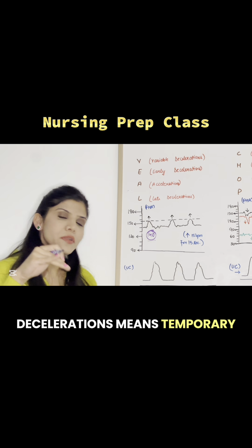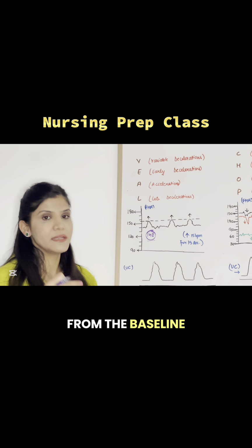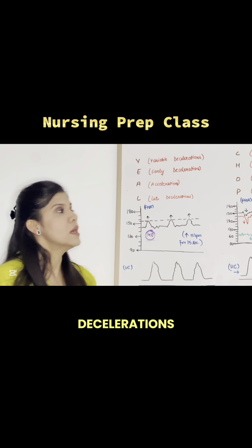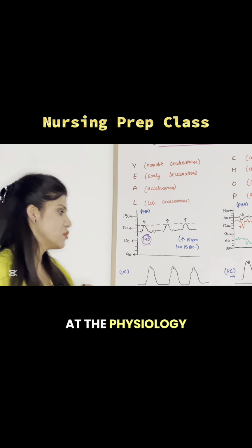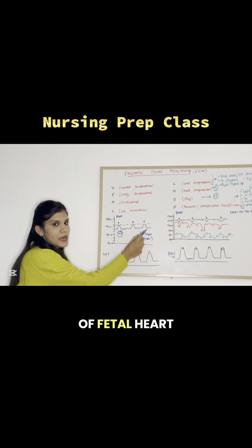Decelerations mean a temporary decrease in the fetal heart rate. The heart rate will decrease from the baseline, and this is what we call decelerations. Now, let us take a look at the physiology. These are uterine contractions, and this is a graphical representation of the fetal heart rate.